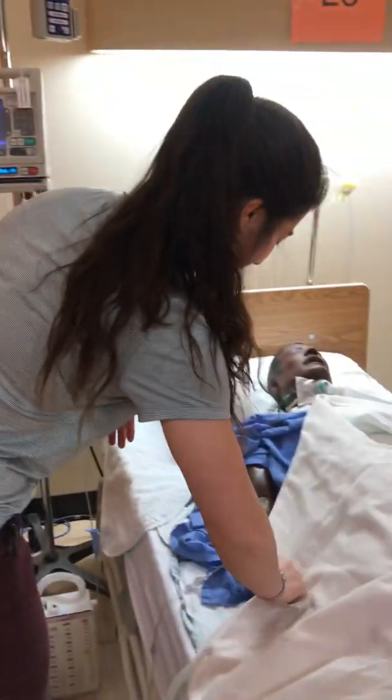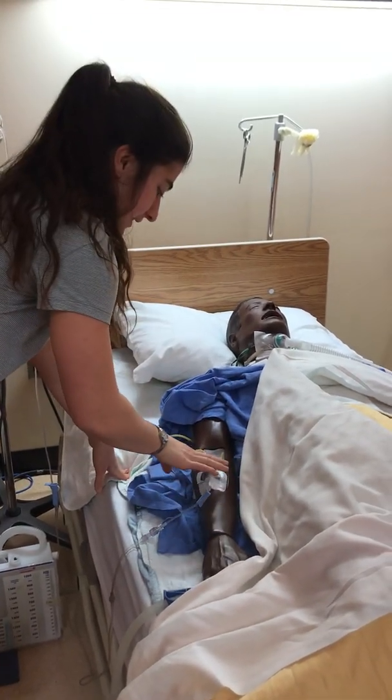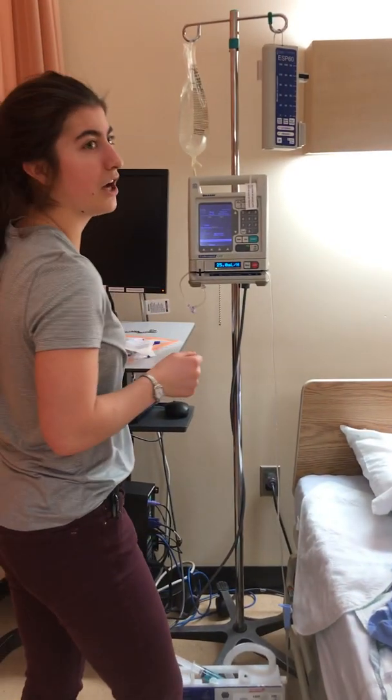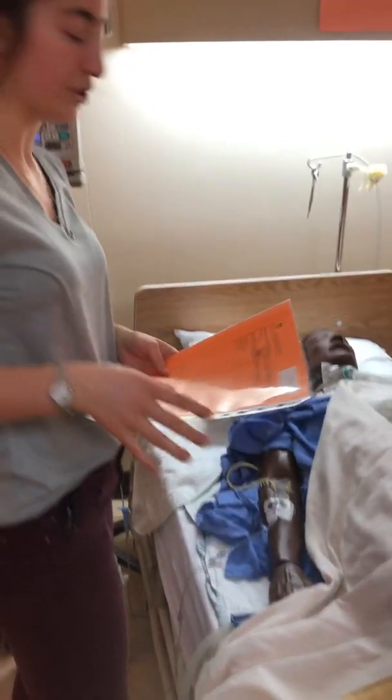Okay. And I'm going to be checking the IV site. Do you know any pain? The patient says no. And there are no signs leaning towards any contraindications for pain. So I'm going to be doing my third and final check.